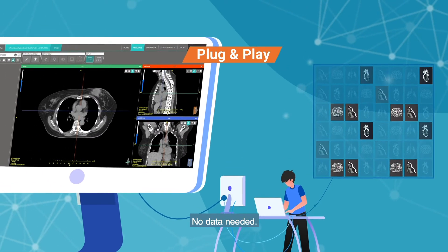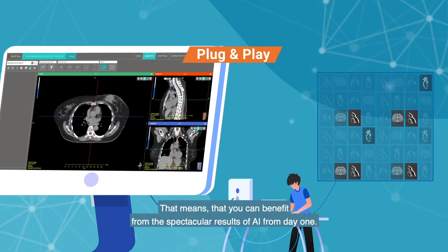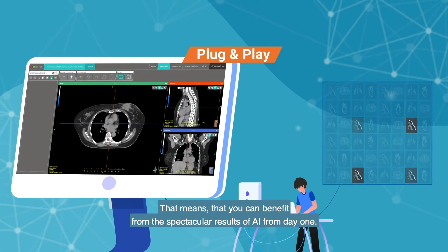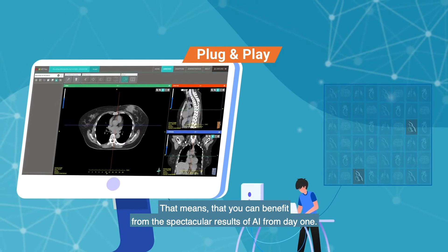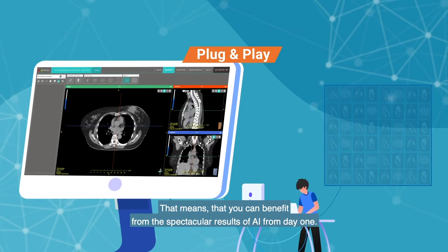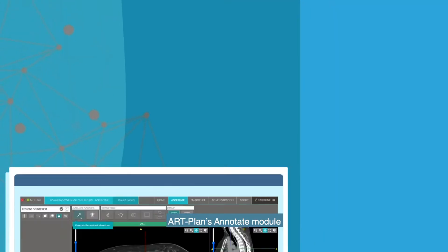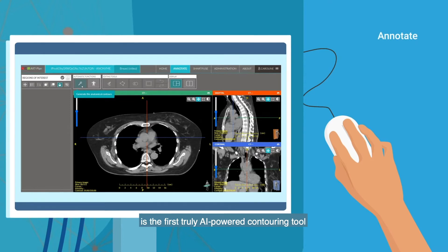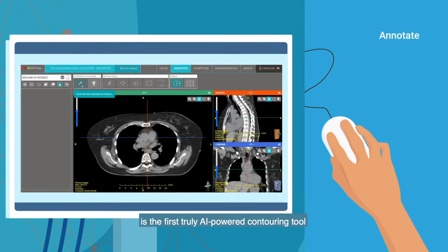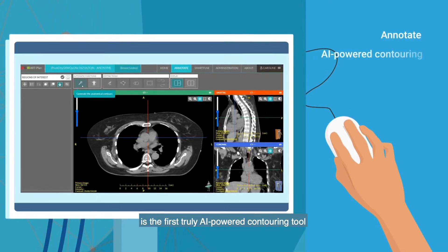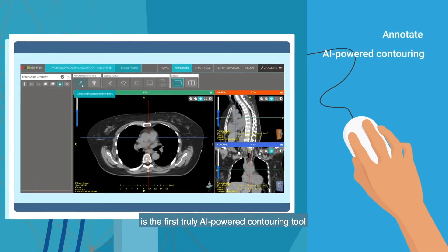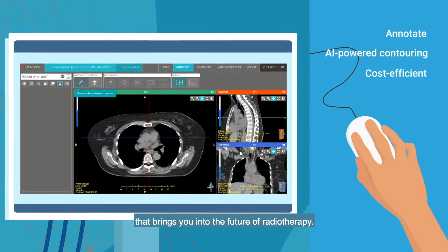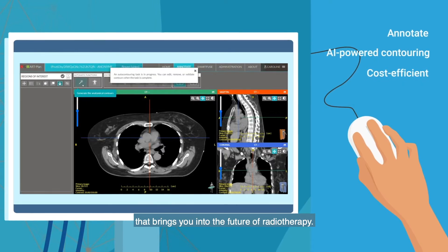No data needed. That means you can benefit from the spectacular results of AI from day one. Artplan's Annotate module is the first truly AI-powered contouring tool that brings you into the future of radiotherapy.